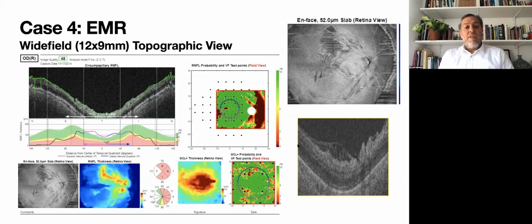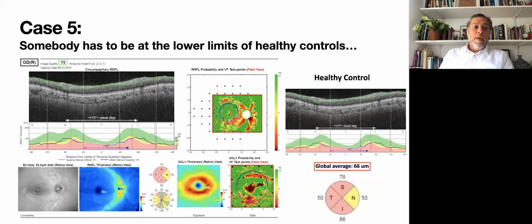We do have visual field testing. Remember, this is a simulation. This is not a visual field testing. We should do visual field testing to compare and agree and have all the different tests, and intraocular pressure and the clinical history of the patients are always mandatory. So remember that not everything is glaucoma. We have to look at the macula, not only for glaucoma, but for other important pathologies.